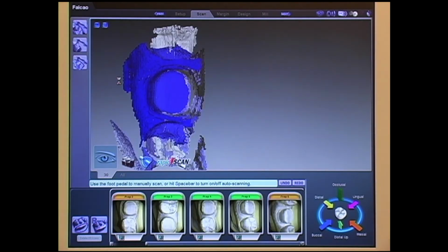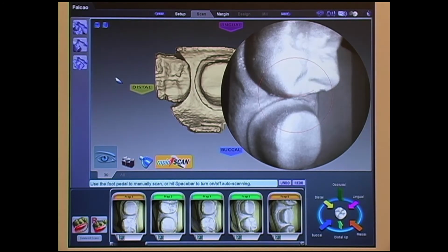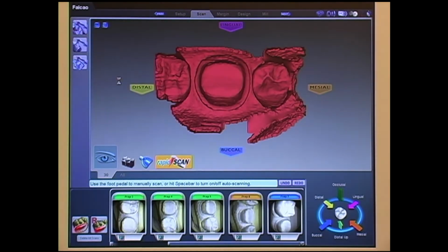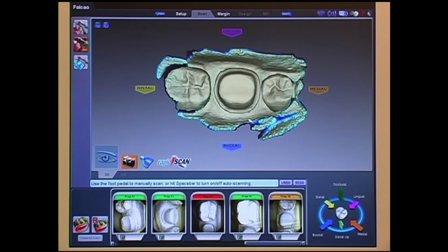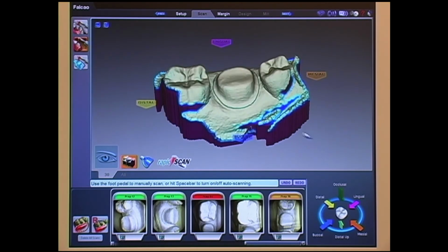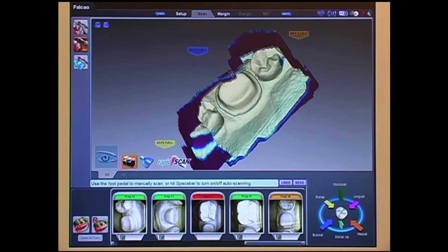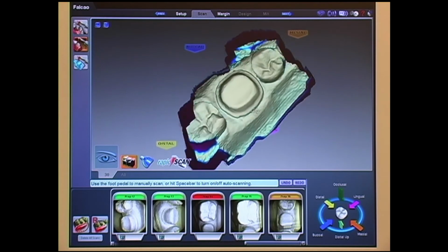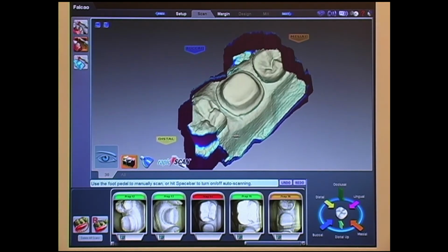It's also very strong. Here at the University of Texas, it's been really great to have this unit here as a teaching tool. The students become more motivated now to learn this type of procedure. We can actually teach them how to do their work better, having the software show us in different rotations how their preparation is, and they can visualize a lot better where the mistakes are. So they learn faster also with this unit.